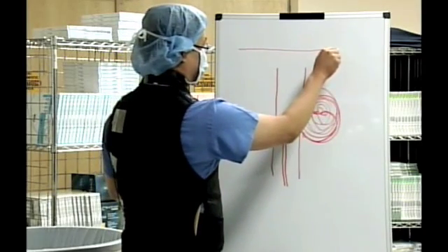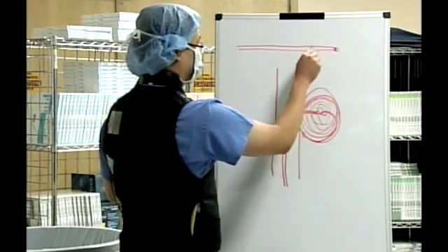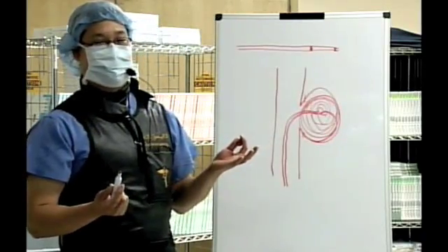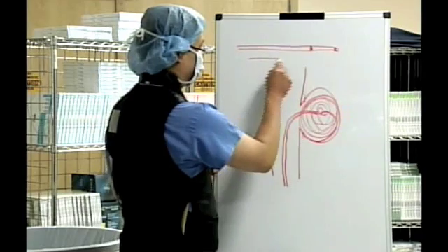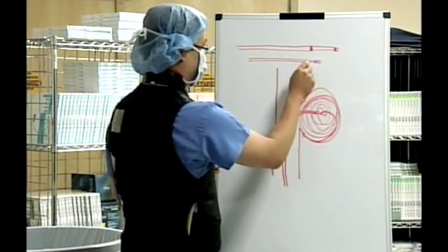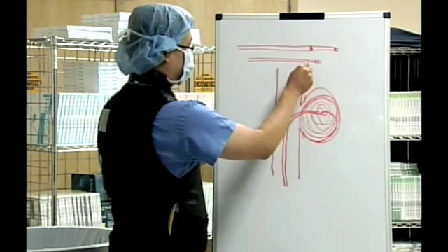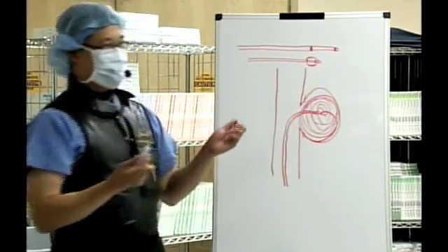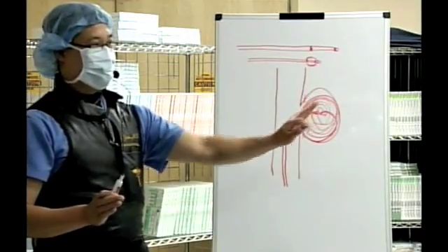The microcatheter has a marker at the tip and a marker here. So you'll see a set of dots like that, and essentially that's all you're going to really see for the catheter. And so that's important to look at. The other thing is there's going to be another catheter. It's called a balloon catheter, but it has two markers like so, and that marks where the balloon part is, and sometimes when we blow the balloon up, you'll actually see it fill up like this. So those are the two basic things you're going to see overall. So just giving you an introduction as to what you're going to see on the pictures.